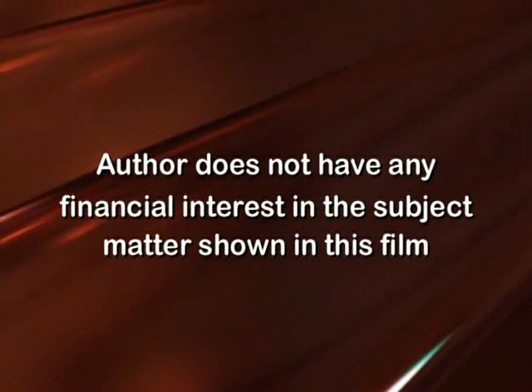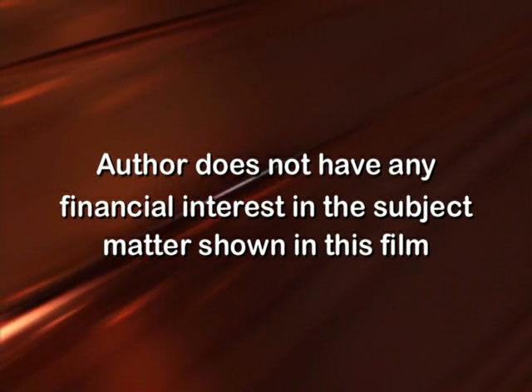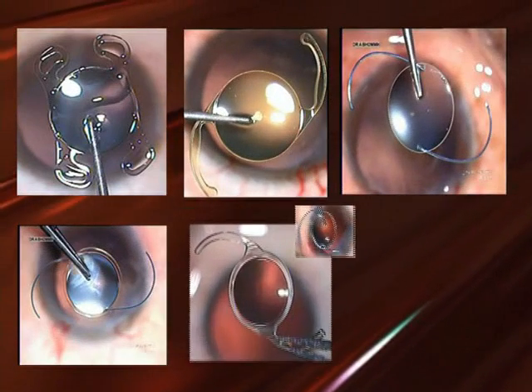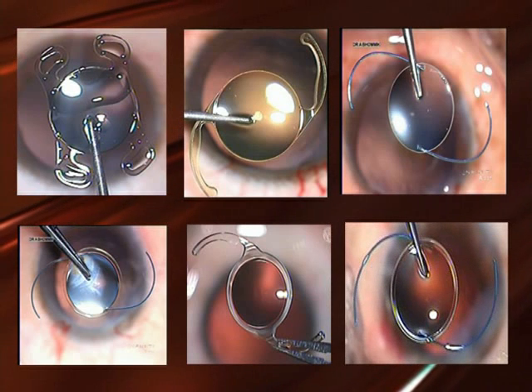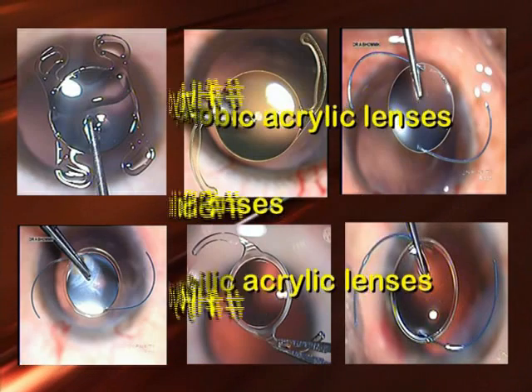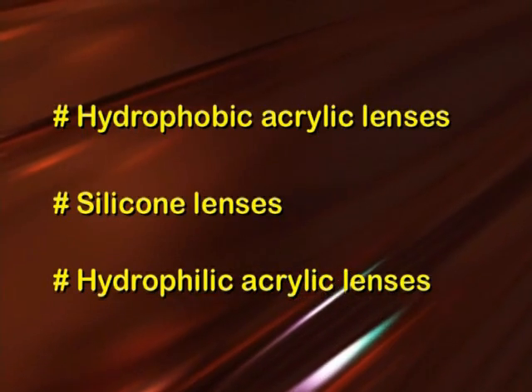We explored various techniques to explant the IOL through the same incision. IOLs behave differently as they are made of different materials, and a single explantation technique cannot be ideal for all lenses. The three main materials are hydrophobic acrylic, silicone, and hydrophilic acrylic.